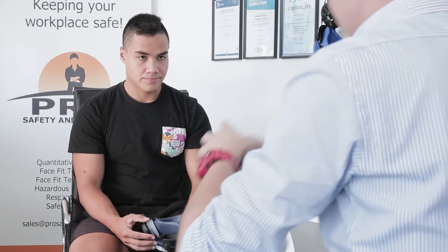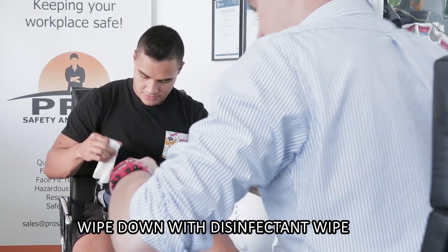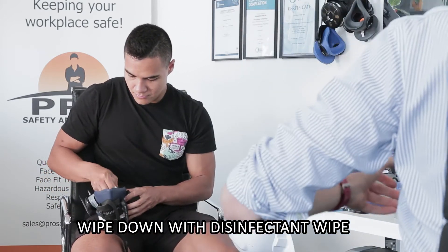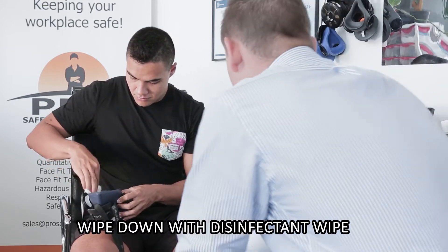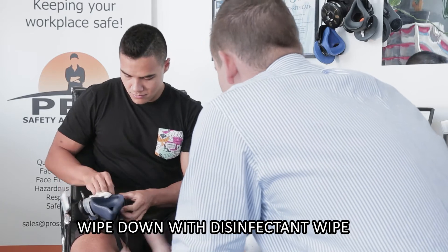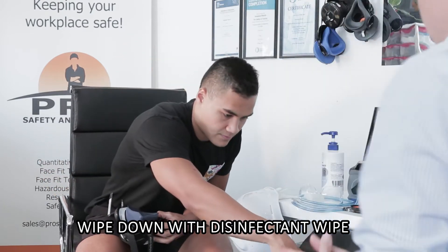Now, before you go ahead and throw that on, if you can please give that a bit of a wipe down, that'd be great. Just on the inside, anywhere you're going to be wearing the respirator — we've sanitized that before the test, but just because I've touched the mask, give it nice and clean. That wipe can go in the bin.